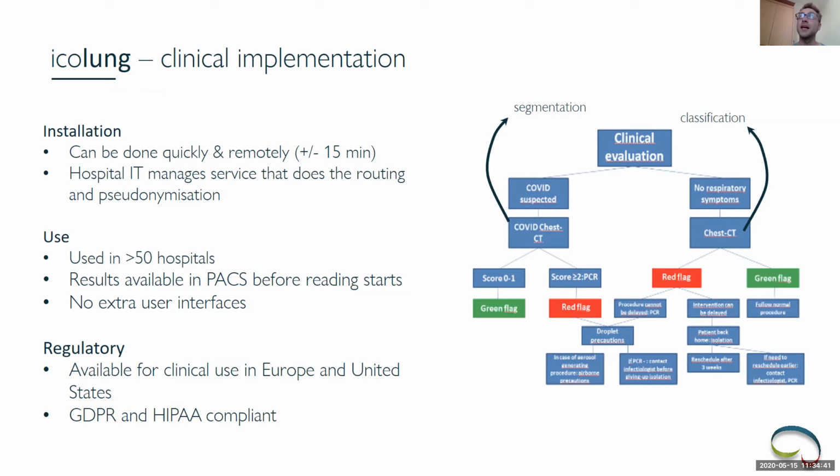But this means that there is also a need to be compliant with the GDPR, the General Data Protection Regulation, which is the European regulation on data privacy. And it asks to do a data privacy impact assessment where you compare the benefits of the solution against the potential privacy risk. And this is an exercise that we have done, and we have also sent to the GBA, which is the Data Privacy Commission in Belgium, to get their opinion.